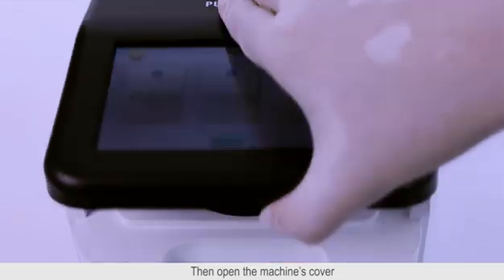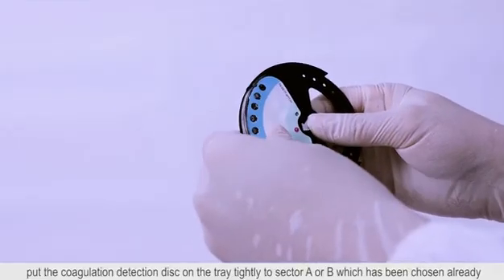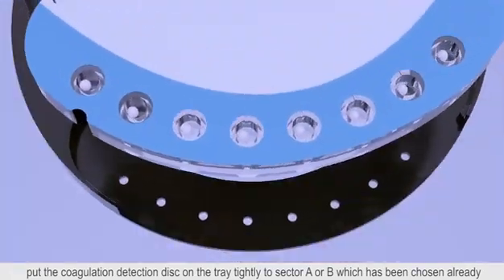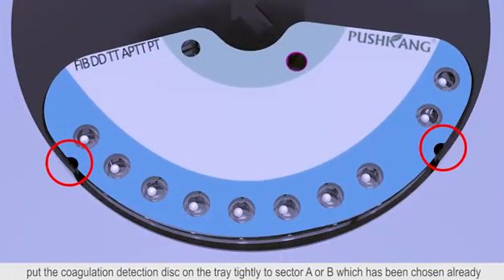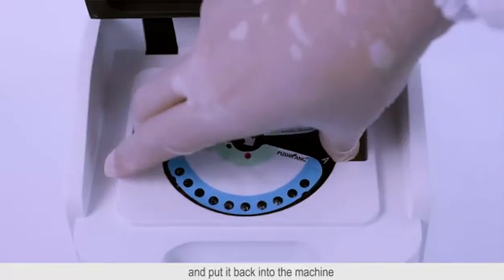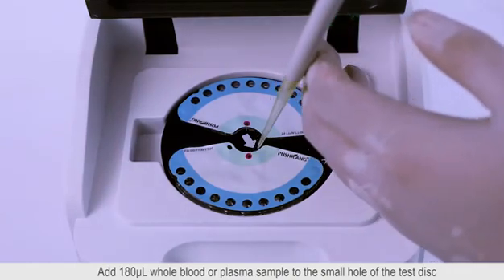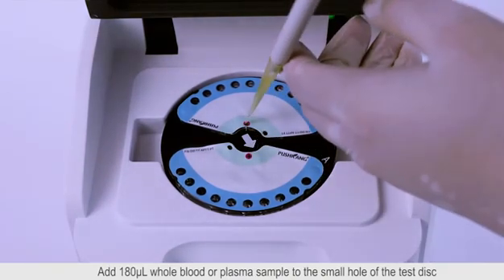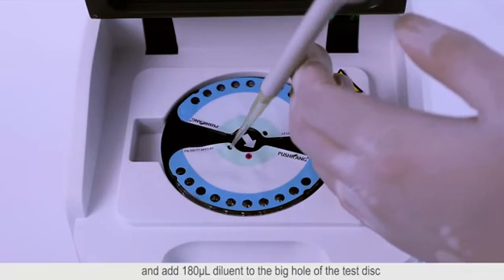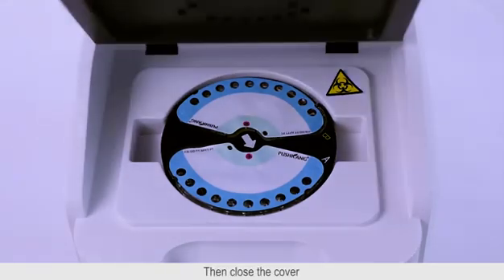Then open the machine's cover and pick up the disk tray. Put the coagulation detection disk on the tray tightly for sector A or B which has been chosen already, and put it back into the machine. Add 180 microliters of whole blood or plasma sample to the small hole of the tested disk, and add 180 microliters of diluent to the big hole of the tested disk.